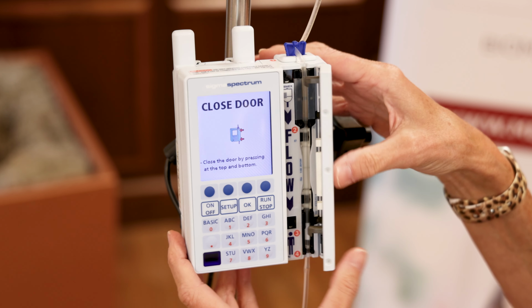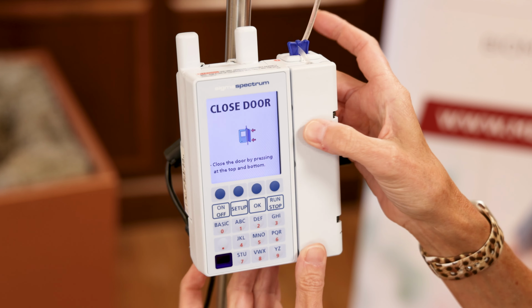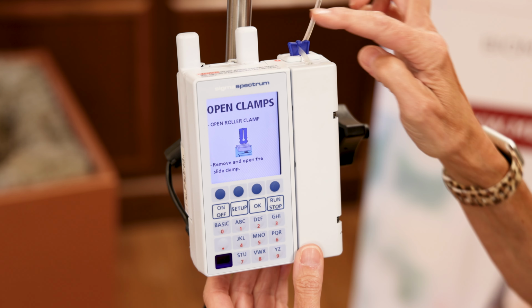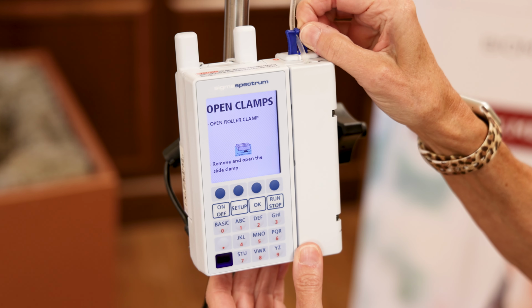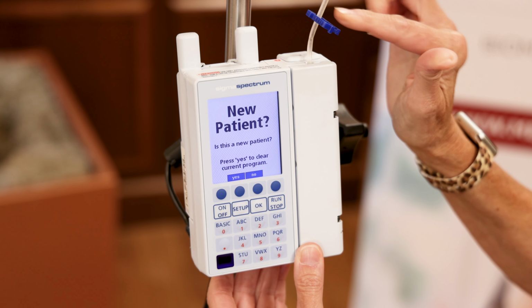Now it's going to tell us to close the door. And then to run, we want to make sure we pull up on the clamp to open it and pull it up and back so that we have released that. It's like a second roller clamp.